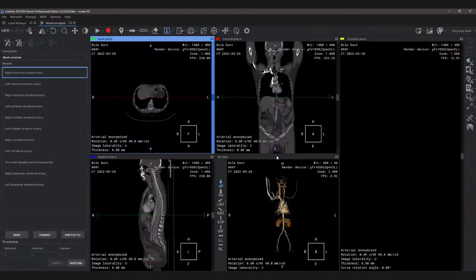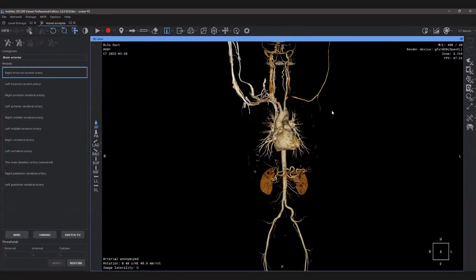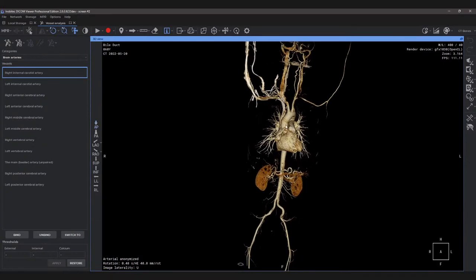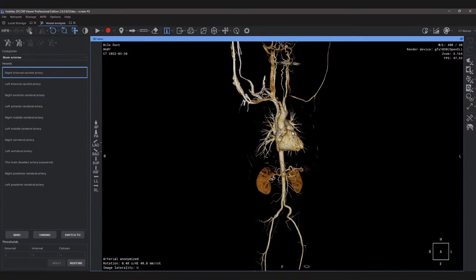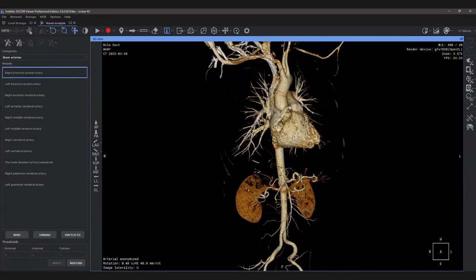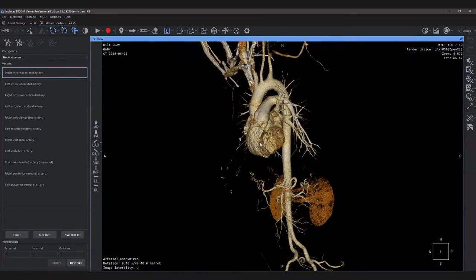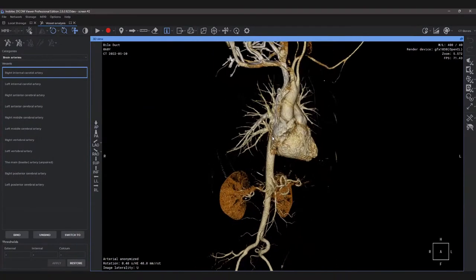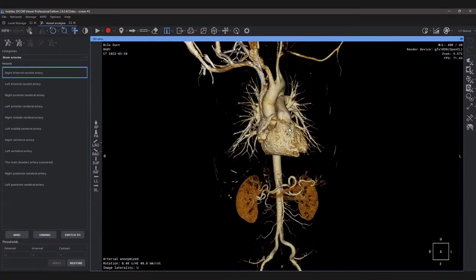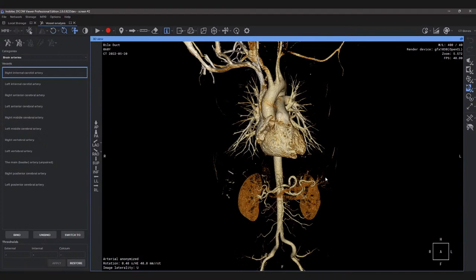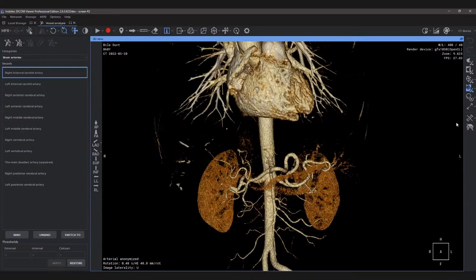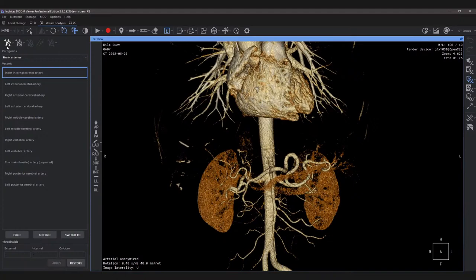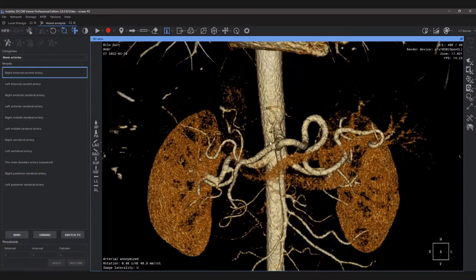Now we are going to switch to the MPR and to the 3D segmentation. The 3D segmentation module has advanced tools for automatic watershed segmentation, semi-automatic region growing segmentation and manual delineation of regions of interest. It provides the possibility to show almost any pathology in 3D, its size, exact positioning within an organ and its relationship with other structures of interest. In order to save time, I'm going to open the projects that I've saved of the segmented structures.